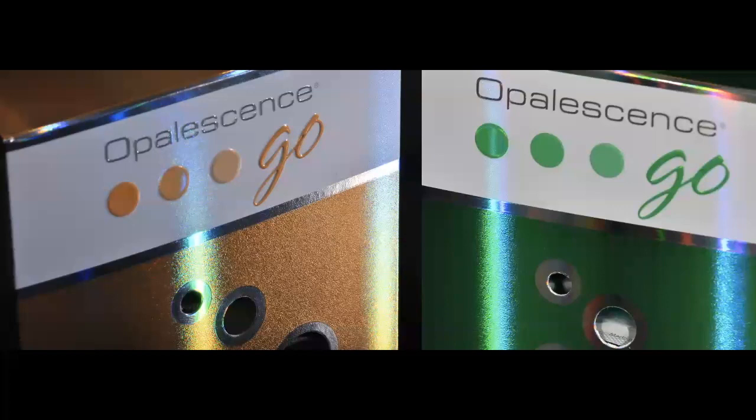And you want to have urea so that the pH goes up. So the way that Opalescence Go controls the pH of the environment is by having carbamide peroxide as part of the gel that you have in these trays, in these prefabricated trays. So that is the big difference between using Opalescence Go, which is a home bleaching system, compared to just using high concentration hydrogen peroxide in your office, which will not have any content of carbamide peroxide. So again, that's a really good tip, something that you should know.